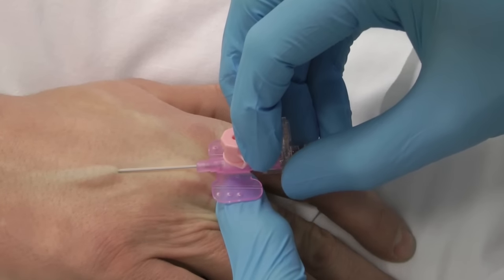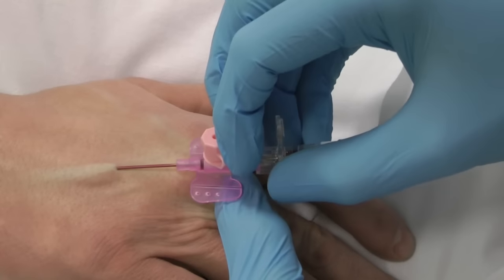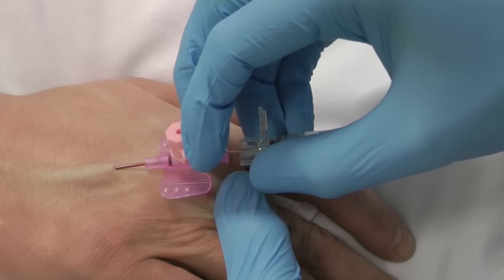Advance the cannula slightly. Then, stabilizing the needle, advance the catheter. Note the second flashback. Fully insert the catheter.